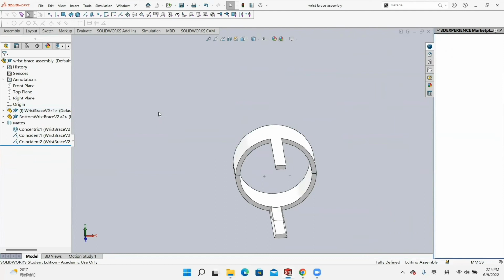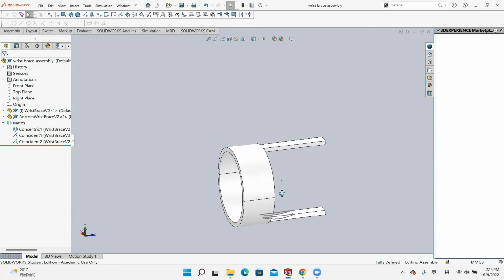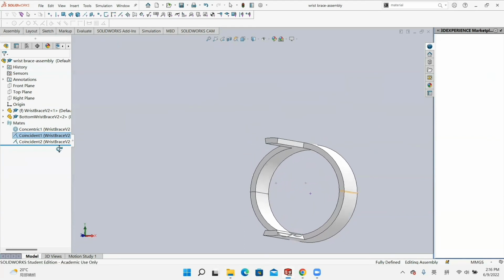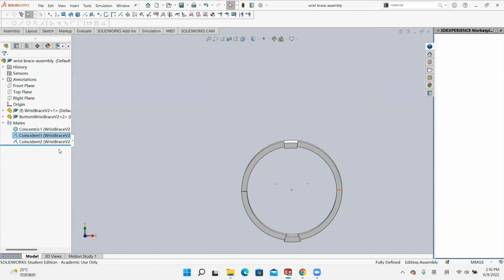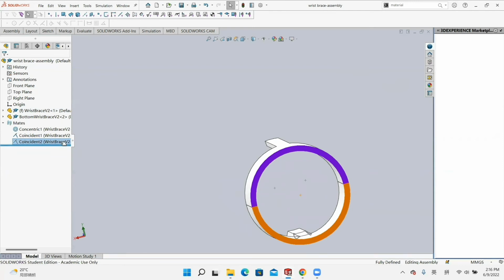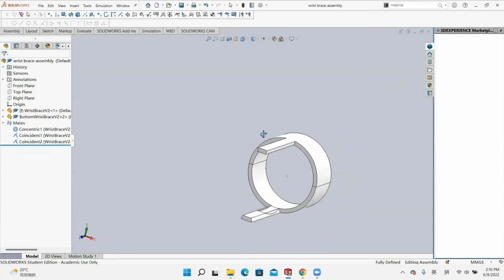The second part is the wrist press part. The wrist press part has the top wrist press and the bottom wrist press. The space between these 2 is where your wrist can put in. So you want your hands to go through inside the faces. Then we need to make these 2 parts contact each other. So we use the concentric mate of the bottom curved face of each other, and use the coincident mate of the corresponding two side faces of each other to make them contact. Also, the same for the back face of the two wrist presses, and it should be fully defined.